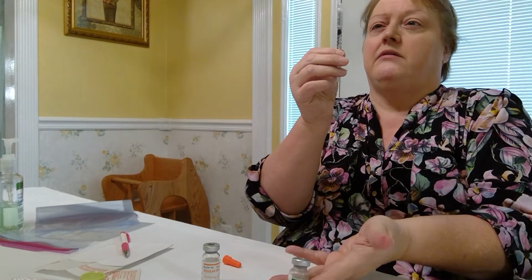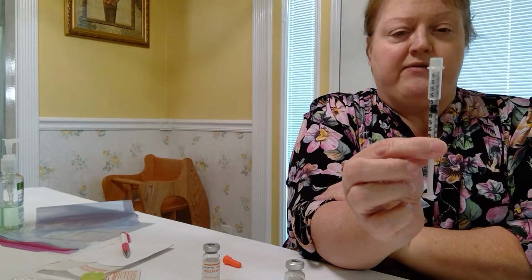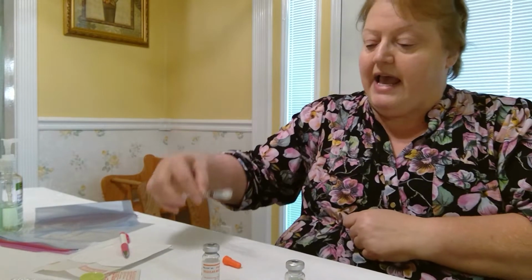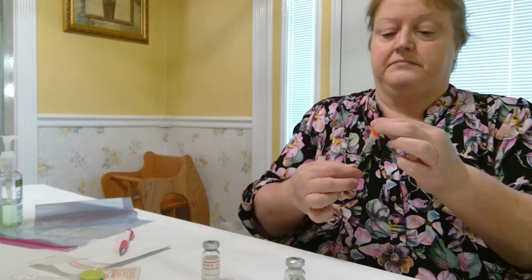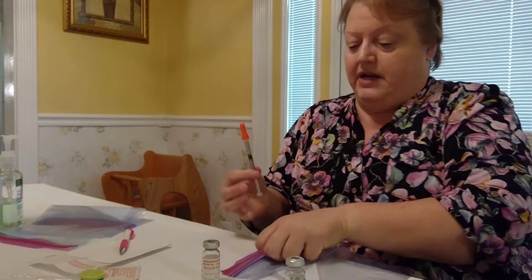Pull off your bottle. Make sure your needle is straight. Demonstrate to us that you have the correct amount, a total of 48 units, and there's no air bubbles. And then scoop your cap. We're going to place this in a bag.